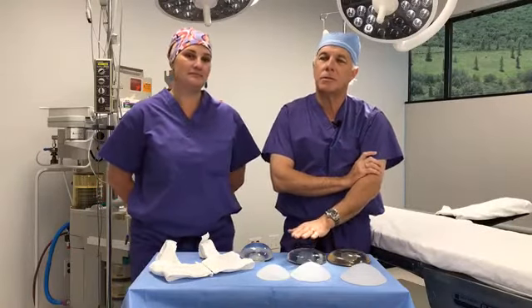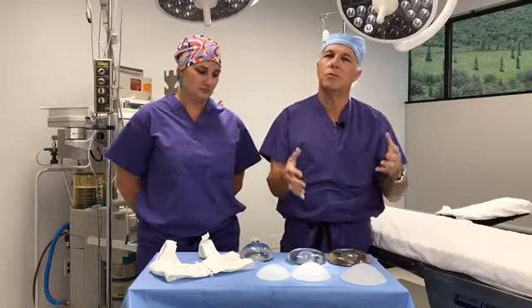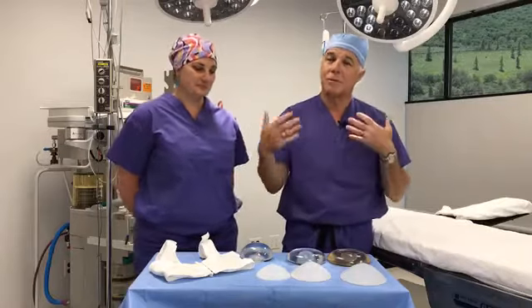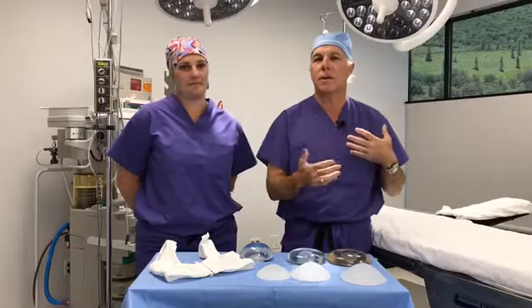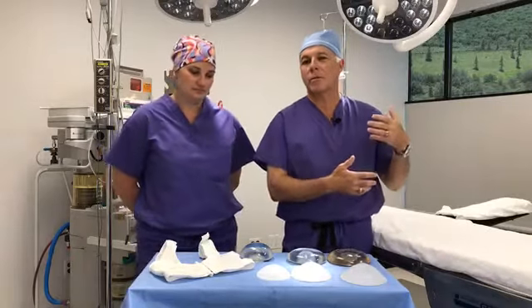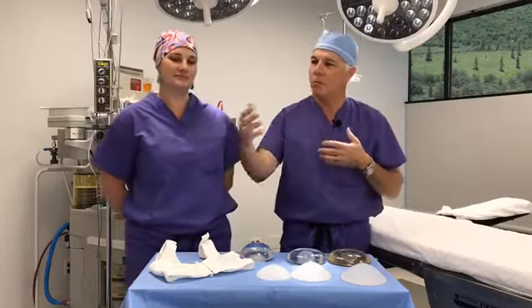And another way to refine that at home is that cubic centimeters of volume is also the same as milliliters. So patients can use a measuring cup at home, and we give them the ballpark parameters, and you can use rice in a measuring cup and put it in a sandwich bag and do some analysis at home, because that gives you your closet, and you can try on different outfits and figure out what volume works with your suit that you wear to work, or if you're wearing yoga tops.